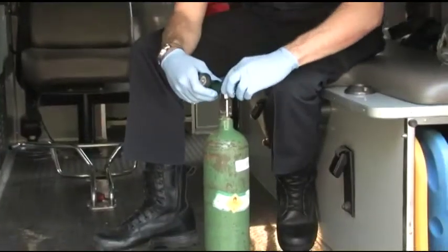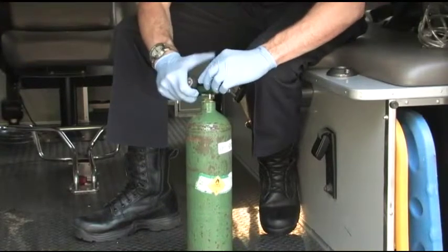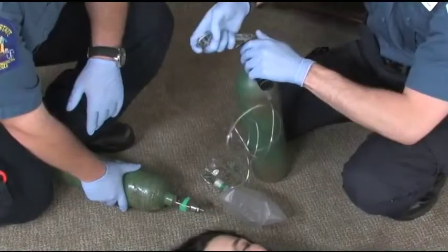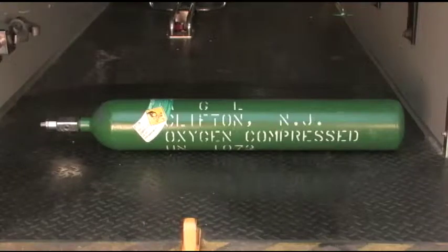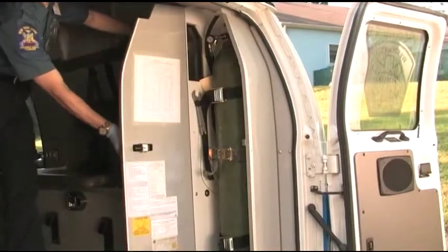The delivery of oxygen begins with preparation of the oxygen tank. You may either assemble the tank for use with an oxygen delivery device, or you may be asked to change an oxygen tank on scene. Portable cylinders for the field include D cylinders, which contain about 350 liters of oxygen, or E cylinders containing about 625 liters of oxygen. Onboard tanks found on the ambulance may include nearly 10 times the volume of oxygen as a portable tank.